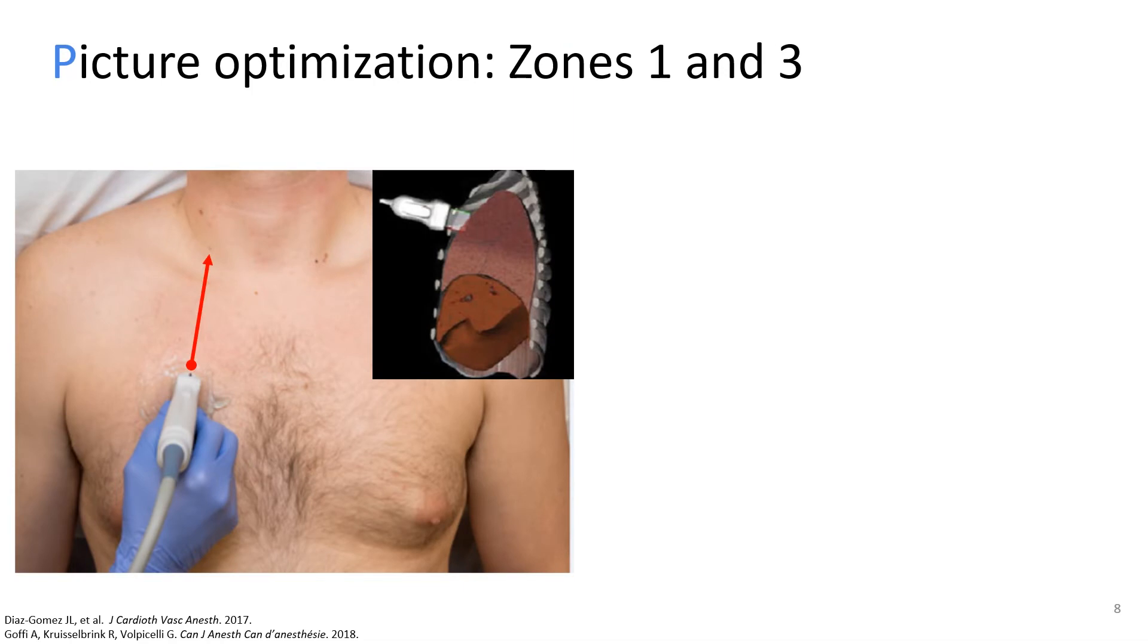Now that you know according to the pulmonary pathologies you want to evaluate how the patient must be positioned, what probe is the most appropriate, and what anatomic zones you should scan, you're pretty much ready to grab the probe, put some gel on it, and start scanning. For picture optimization, I will go over tips for probe manipulation and visuospatial orientation such that you get the best image quality possible.